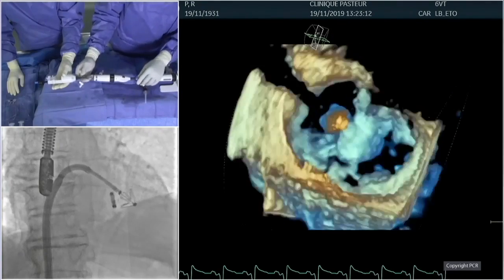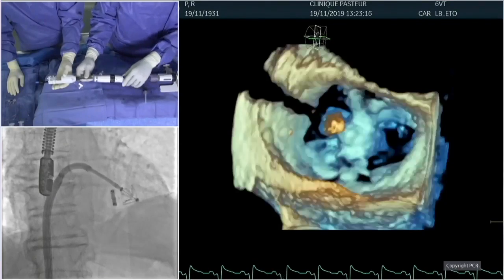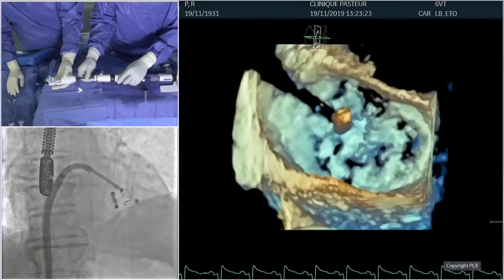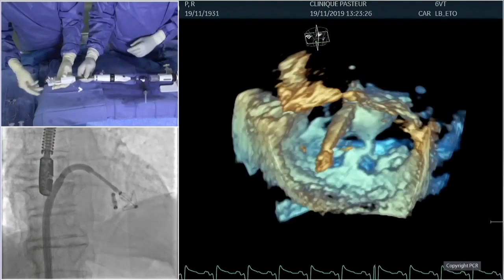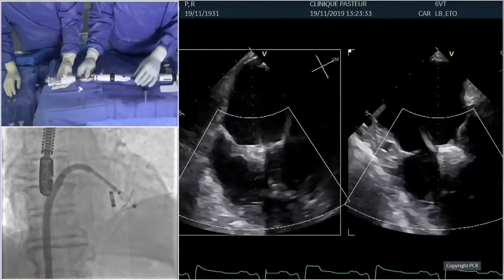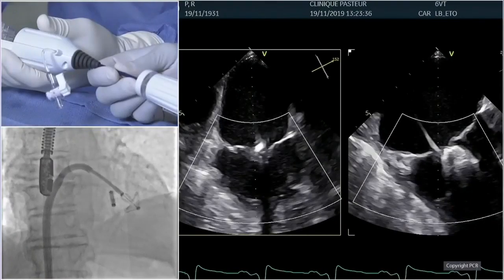Okay. Yeah, it seems that we are not seeing the device. Difficult to see. There is shadowing. But the device is a little bit deeper. You might want to move the 3D box into the ventricle a little bit more. Okay, and it's a little bit close also, so you have difficulties to see. So I open it a little bit more, and it should be easier to visualize it now.